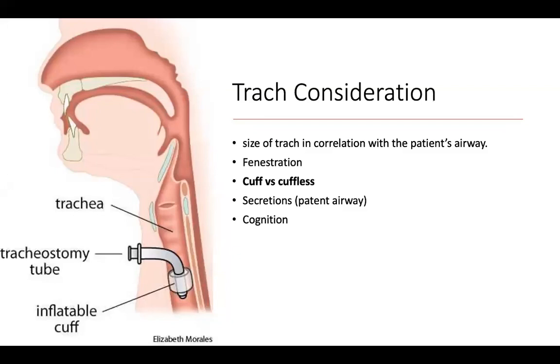Someone is asking, if you use the speaking valve directly after the trach is inserted, does that patient need any training to phonate while using the speaking valve? We don't put a speaking valve on directly after the trach is inserted, because it's surgically inserted, so the patient might have bleeding or edema, and probably won't be a candidate at that time. We will talk about candidacy right now, and it will make sense as we go.